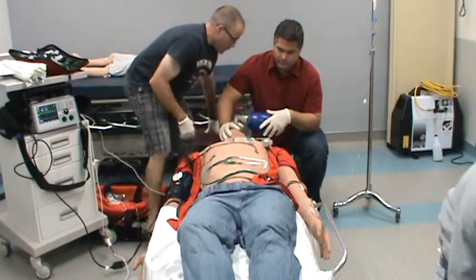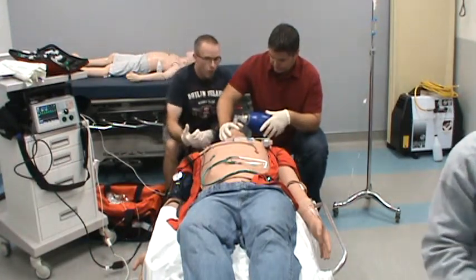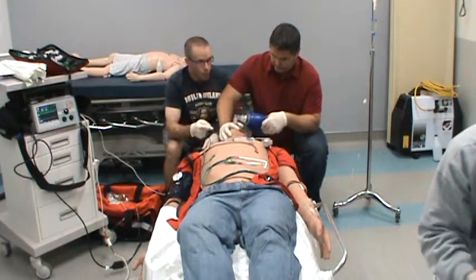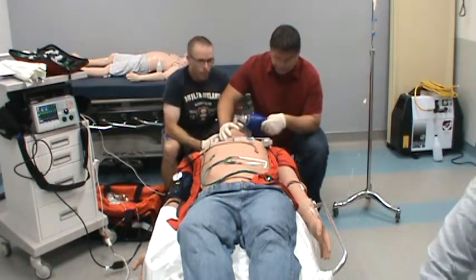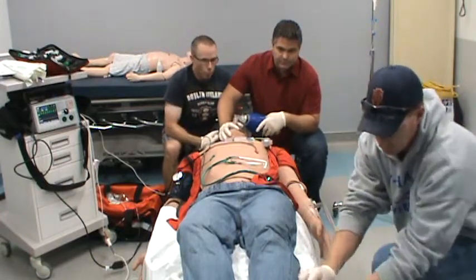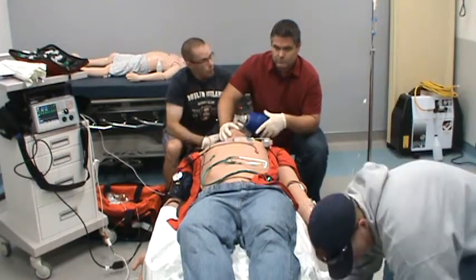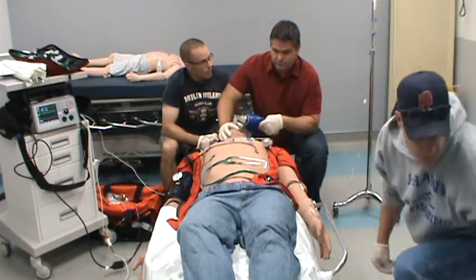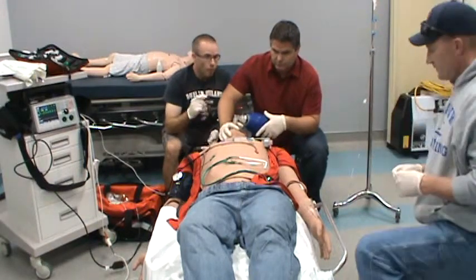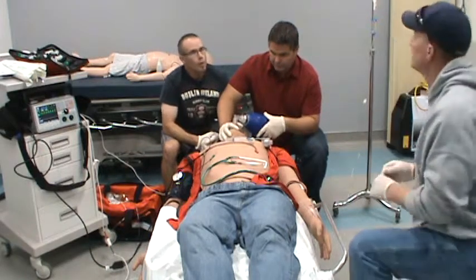So, when we get to the point where I'm going to intubate the guy after we have the meds on board, once he starts giving the ketamine, I want you to do some crike pressure for me. And then once I go to intubate and the Sux is on board and we're done seeing fasciculations and all that, I'll have you continue to hold that as I go in to intubate, and if I need to move it around, I'll keep your hand right there. Also, when I'm ready to intubate, I need you to hand me the tube, okay?